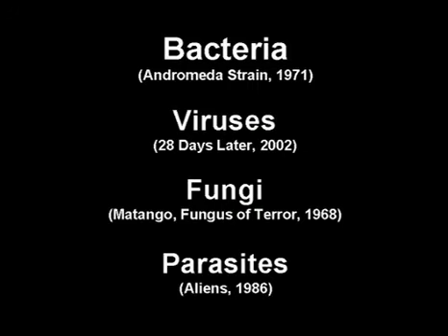But even still, despite what we can see insofar as complications or the effects of these diseases, we tend not to be as specific as some of the serologic or other testing parameters which the clinicians may have. So what I'm hoping to do today is just go over some of these diseases, present a more image-heavy type of presentation so that we can all relax and hopefully confer some additional information as well.